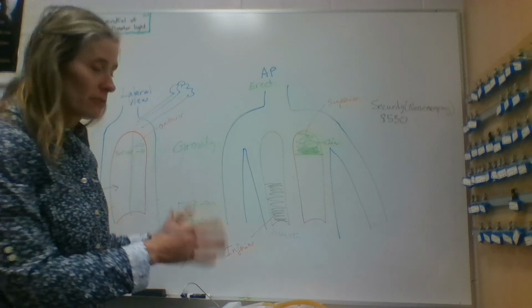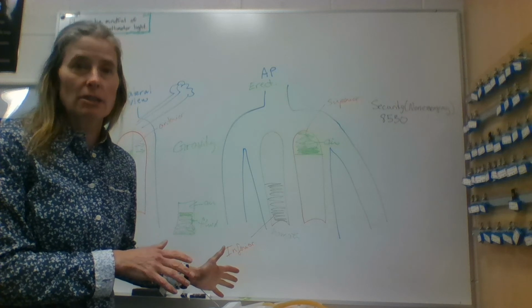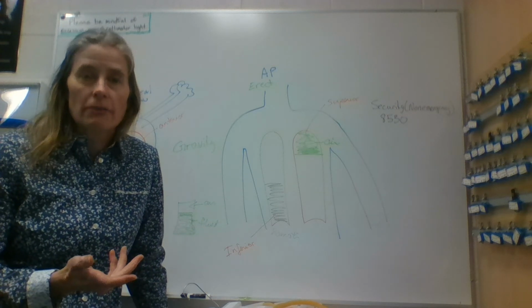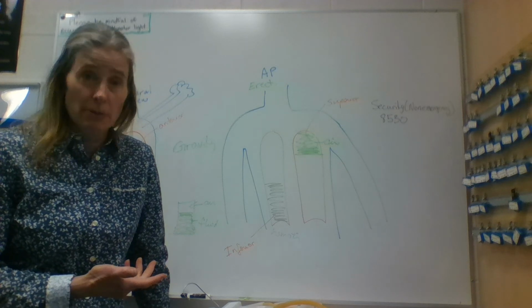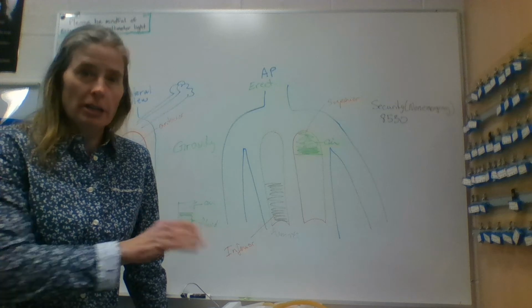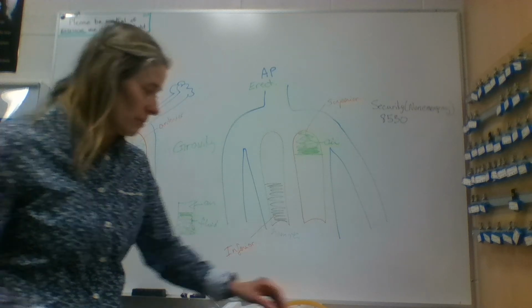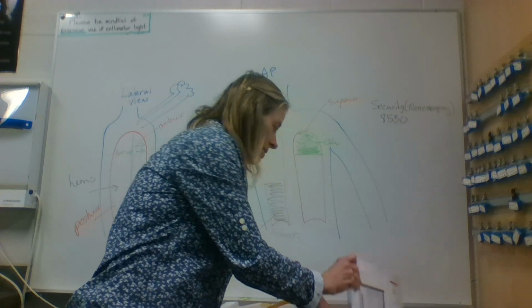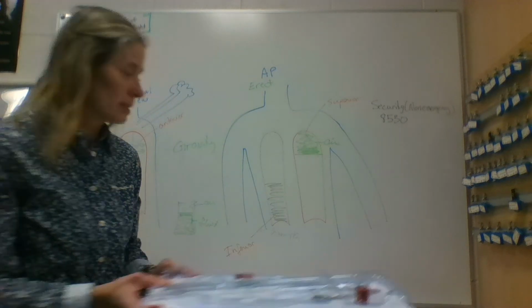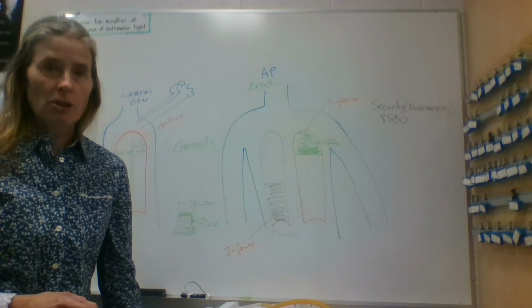These pre-assembled kits for chest tubes will be located in the diagnostic imaging department, usually among where angiography and CT are. You're not going to have to go running around trying to assemble this and know what's on it. It'll come like this one, an example: pre-packaged, everything you need to go. That's something along the lines of your chest tube.